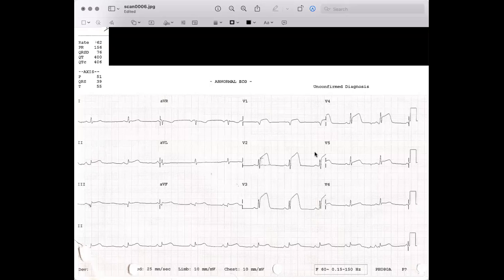I'm more than happy to do it, and we go on a deep dive, for example, into the rate and the rhythm. I'll show you the pathologies, because once you see them, you're going to have pattern recognition. But before we jump to pattern recognition or identifying abnormalities, I really want you to develop the habit. But you did very well.